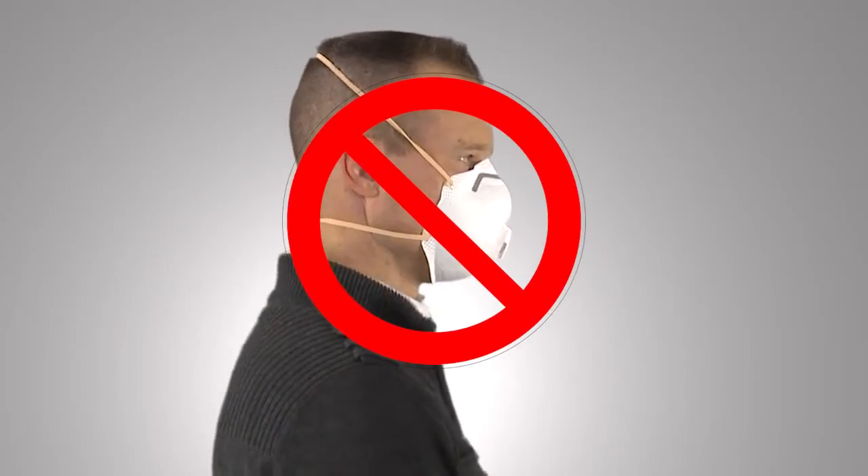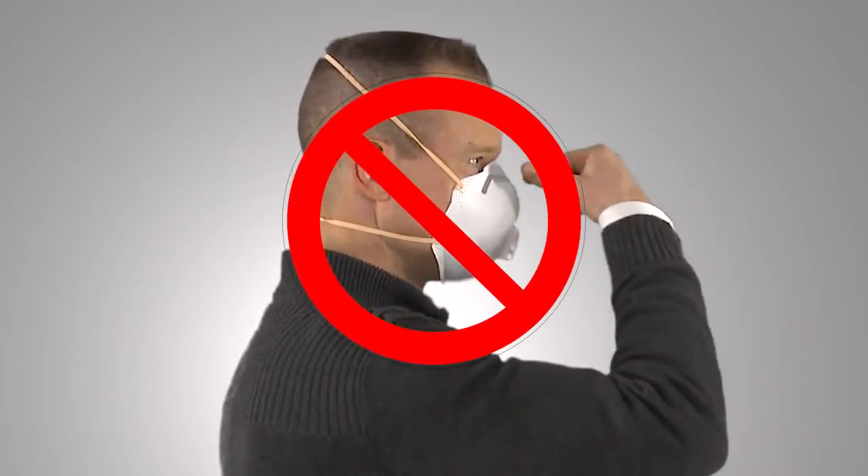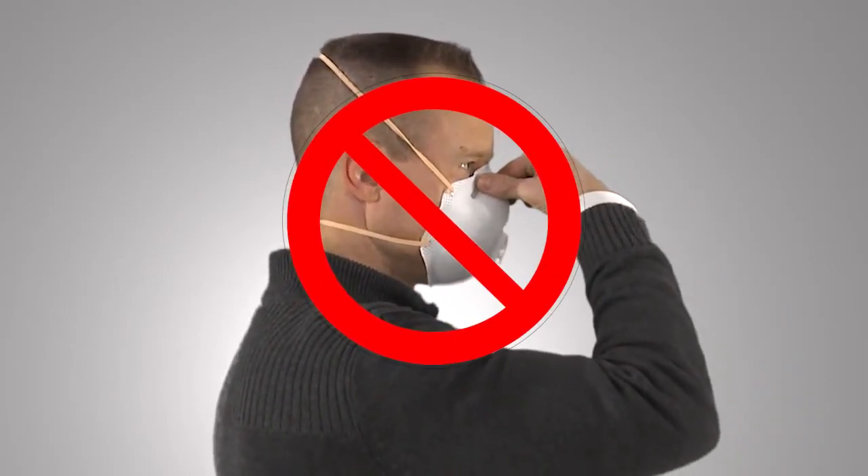Note: pinching the nose piece using one hand may result in an improper fit and less effective respirator performance. Use two hands. Be sure to follow the proper user instructions included with your respirator.